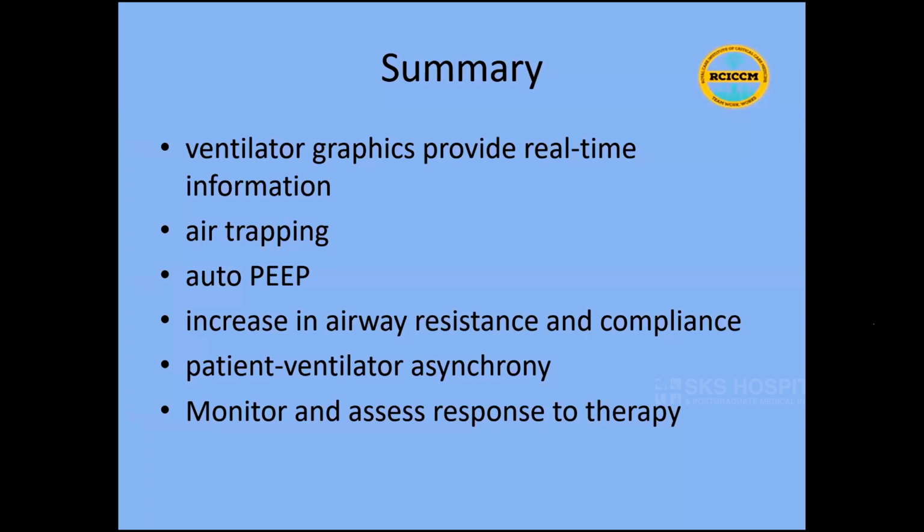So monitoring and assessing response to therapy is vital. Simple maneuvers like seeing a sawtooth pattern on these graphs can tell you that there are secretions, and suctioning the patient can very well relieve it. So it can be quite worthwhile looking at these graphs, which are real-time information, and providing the appropriate therapy.